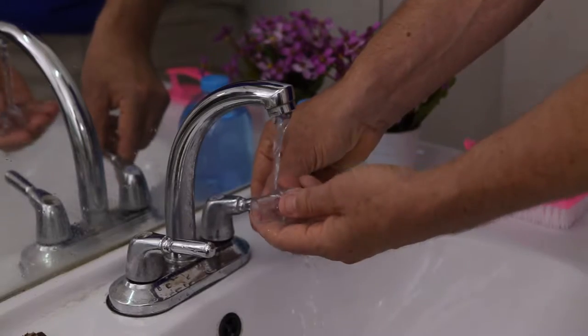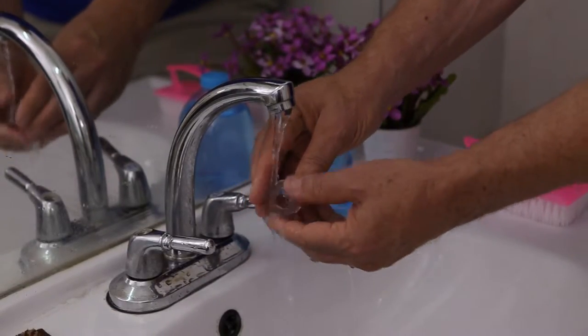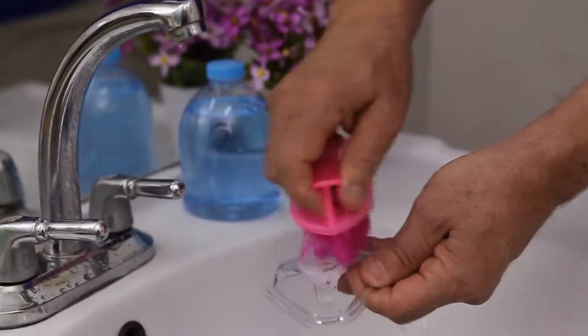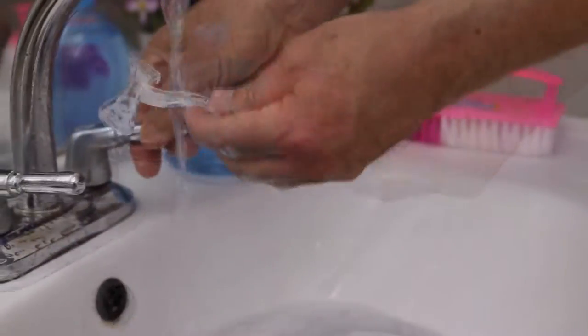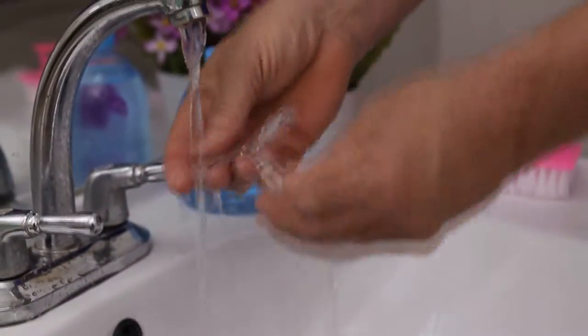Clean the air tubing by soaking it in detergent or rinsing in a warm water solution. A soft bristle brush will be helpful for the hard plastic parts. Rinsing the air tubing with warm drinking-quality water is recommended. Allow the components to air dry out of direct sunlight.